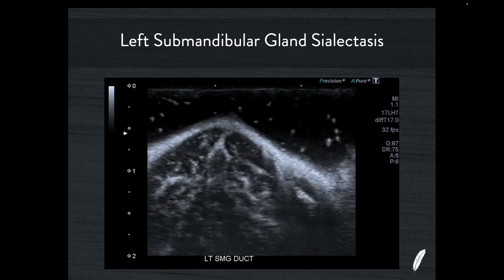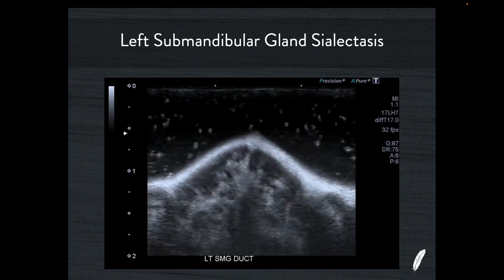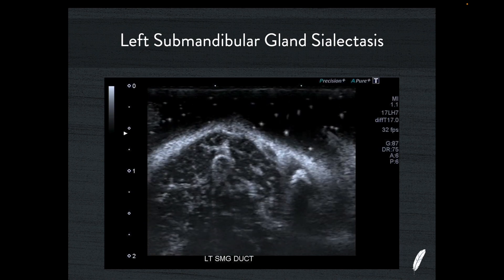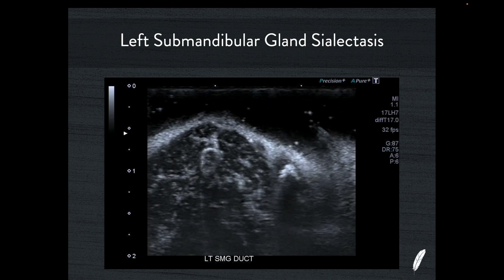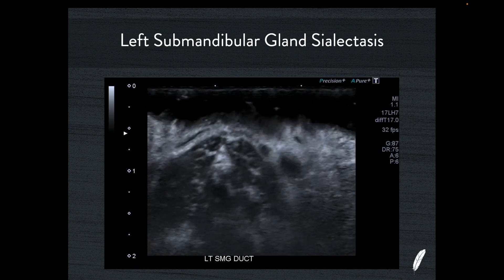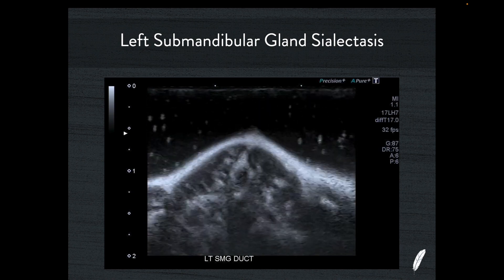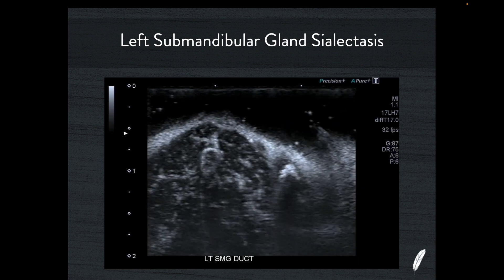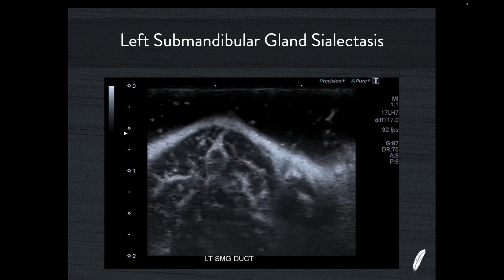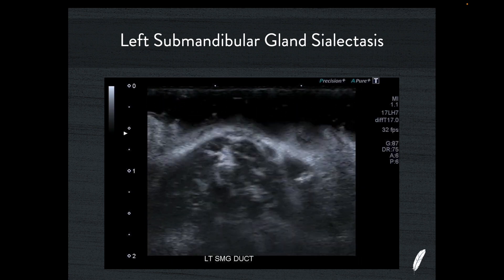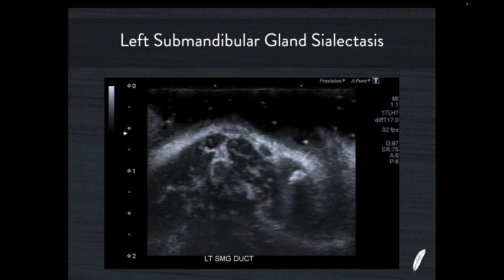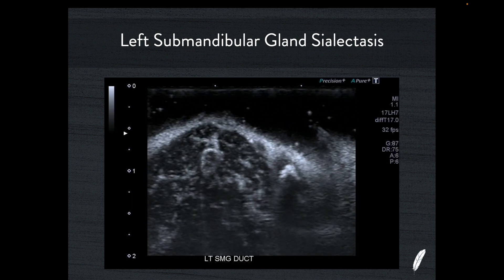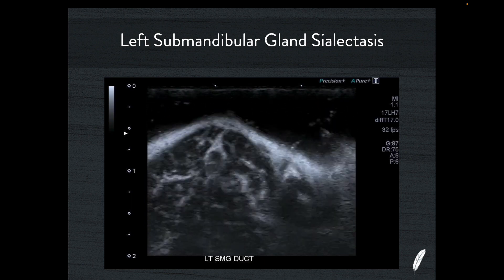Here's another video of the same calculus — you can see it just sitting in the terminal end of the duct. The little bright things swimming about in the fluid are just air bubbles trapped inside the water poured into the mouth. You can also see the way I'm standing well off, letting the transducer just float in the bath of water.